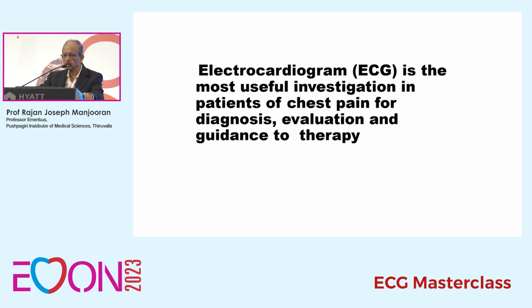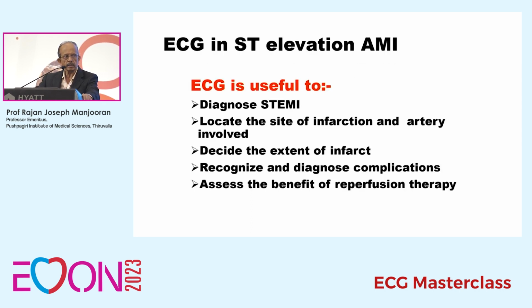Electrocardiogram is the most useful investigation in patients with chest pain for diagnosis, evaluation, and guidance to therapy. ECG is useful to diagnose STEMI, locate the site of infarction and artery involved, decide the extent of infarct, recognize and diagnose complications, and assess the benefit of reperfusion therapy.